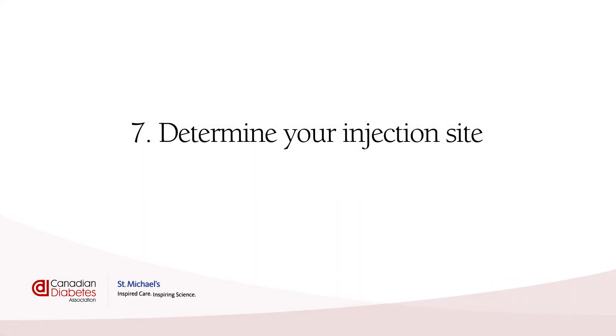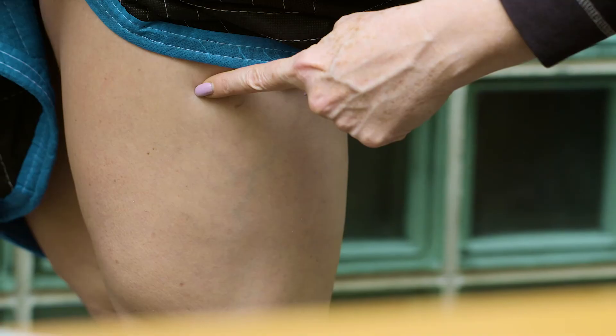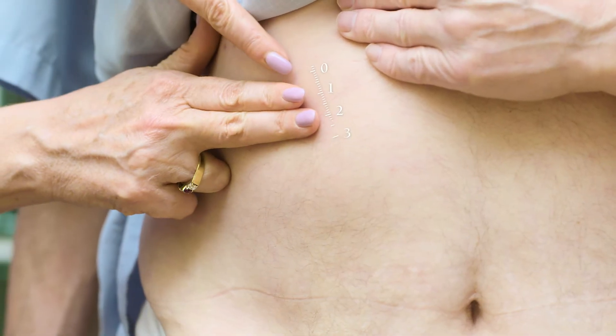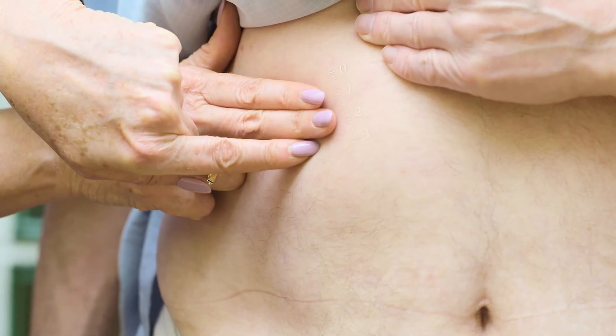Determine your injection site. There are a few options for where to inject: your belly (but not your belly button), the outside of your legs, the back of your arms, and the top of your bum. See what works best for you, but you'll probably find that it's hard to inject yourself properly in hard-to-reach spots like your arms or bum. It's not a good idea to use the same spot over and over because you might get lumps and bumps under your skin. Switch the spots you inject in, at least two to three centimeters away from your last injection — about the width of two fingers.